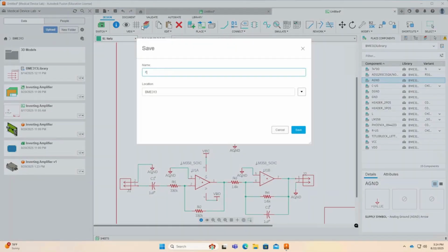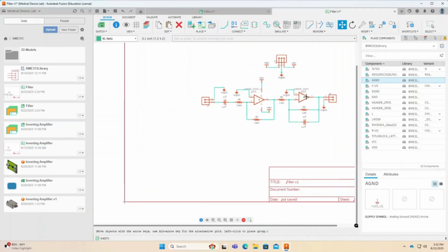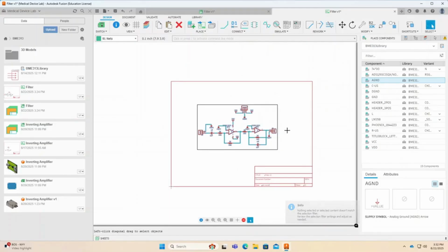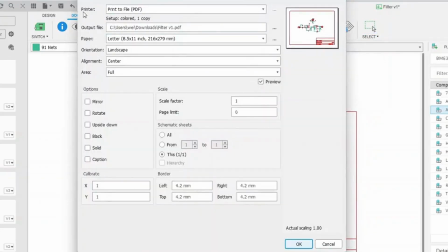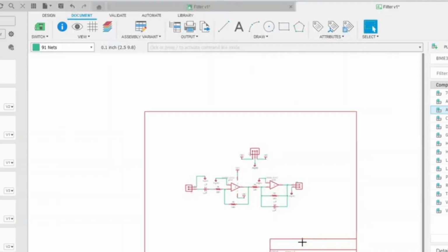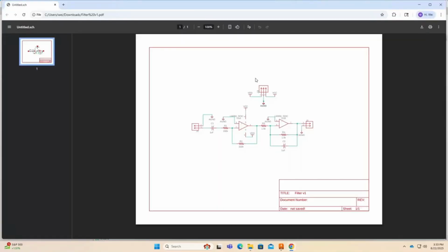Save the file and name it Filter. Before printing, center the schematic within the title block. Select all components, move them to the middle, and zoom out to confirm the placement. To print, go to the Document tab, choose Output, Print, select Print to File, PDF, choose the output location and click OK. In your Downloads folder, you'll find the generated PDF containing the completed schematic.